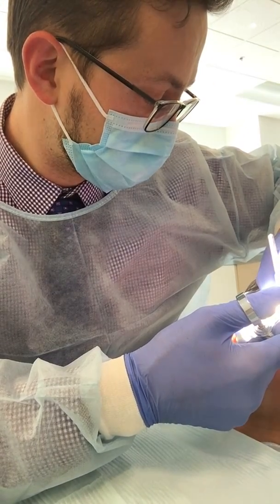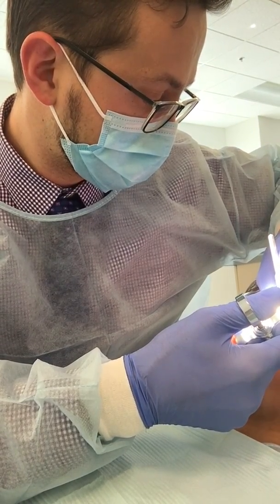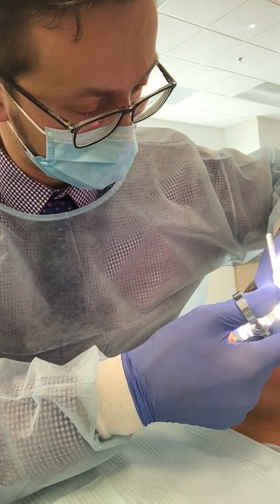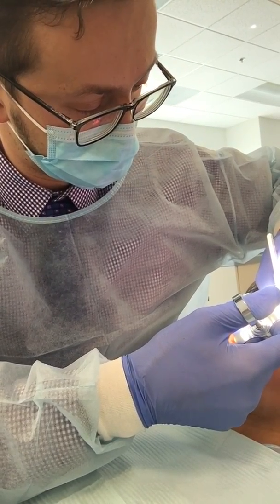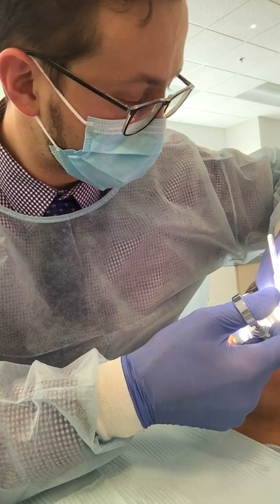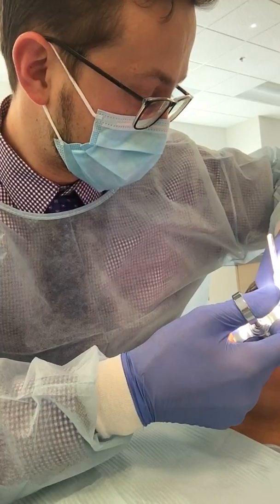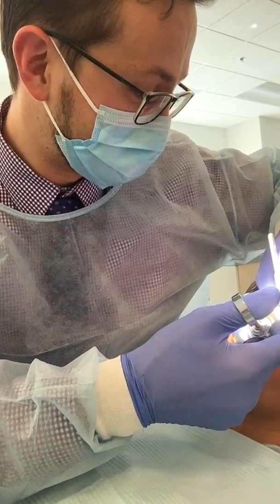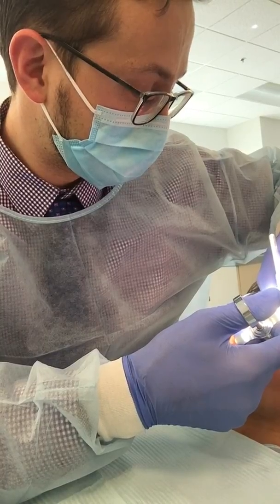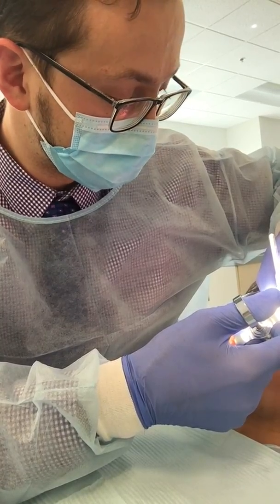Do you feel it coming in? Mm-hmm. You do? I'm good. A little bit, huh? Okay. Doesn't hurt? No. Good. We're coming in really slow. Yeah, actually we're extremely slow. You can speed up a little bit after you've got about half of that in — so if you're starting to go numb, then you can speed up just a little bit. Go nice and easy.